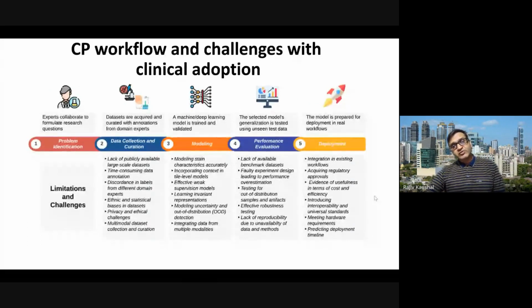So this is the workflow for the adoption or development of any model. First and foremost, you have to keep in mind what your actual problem is for which you want to use a particular AI-based application. Try to look at its pros and cons, whether it is really relevant.